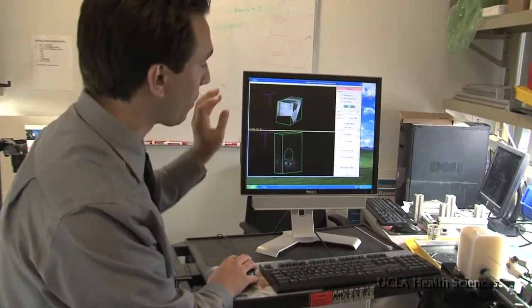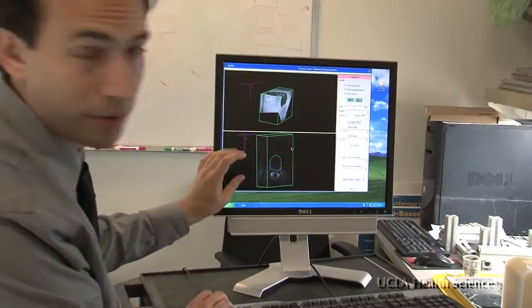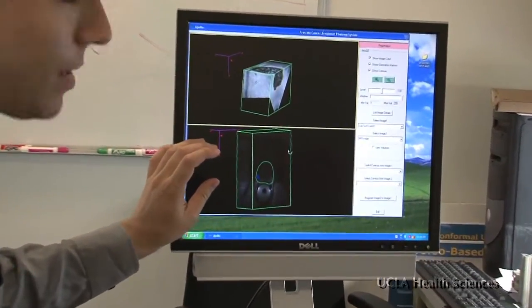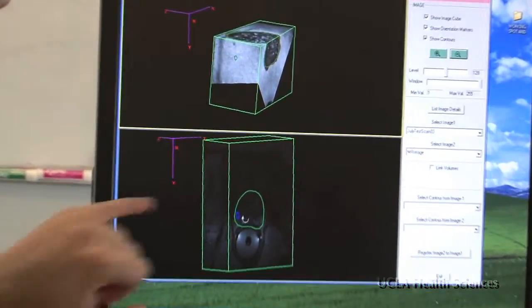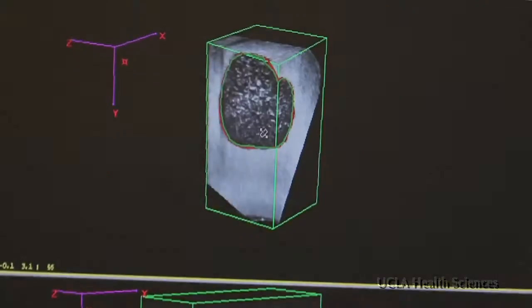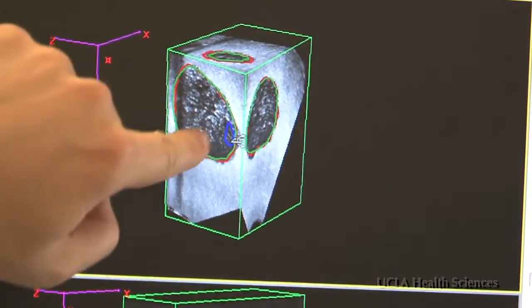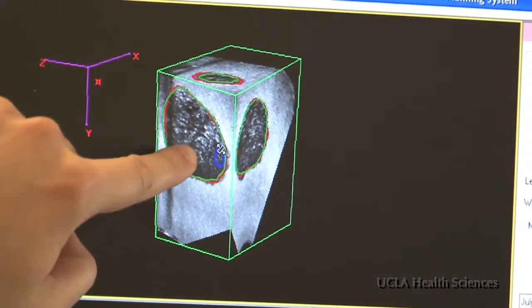Here we have two three-dimensional images: the ultrasound image of what we're doing to the patient right now and the MRI image taken by a radiologist ahead of time so we can see the cancer. By fusing these two images together, we can reestablish the exact location of the patient's tumor in the doctor's office.